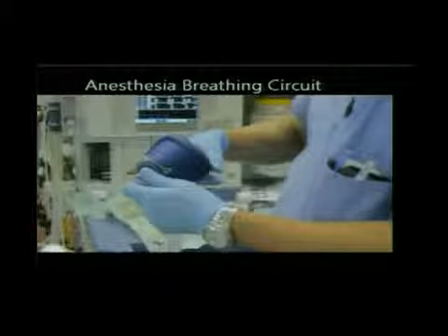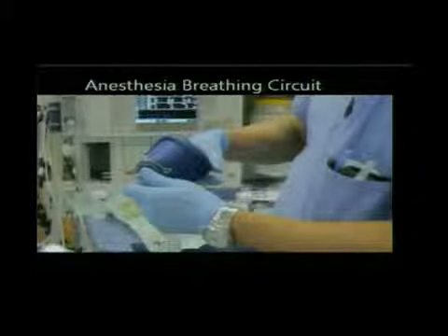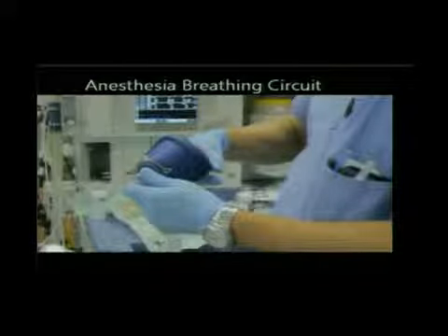There's a mask which you can see there, and if you could just wait for one more moment, Mr. Walgren. There's a mask you can see there that goes on the patient's face, and we learn how to hold the mask so there is a tight seal on the patient's face. And then there is a bag that you squeeze, and that pushes the air into the lungs. So that's coming up here.